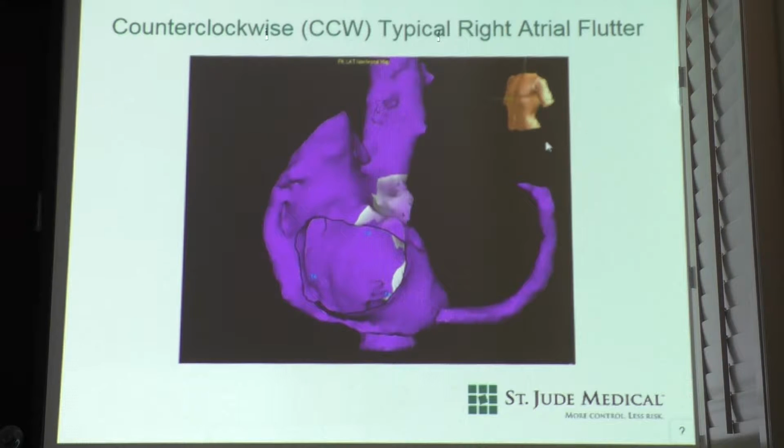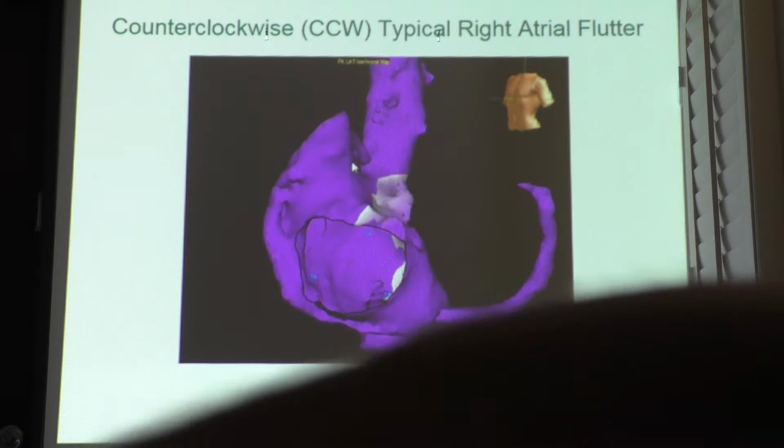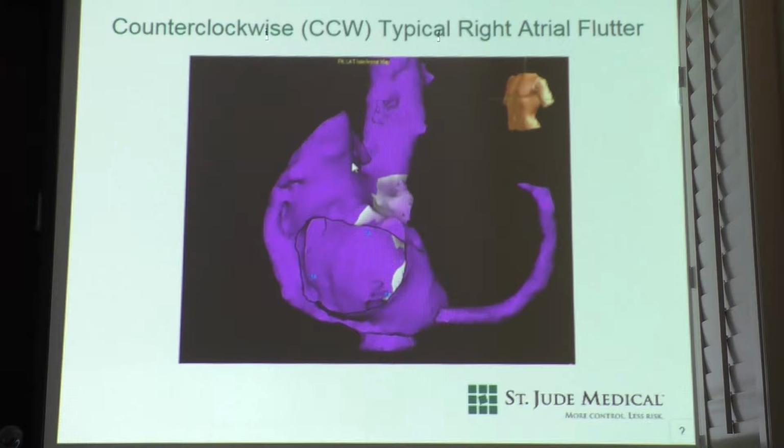And here's a good picture. So this is the inside of that chamber rendered on our mapping system. So what's the tail off to the right? Where'd the little stem go? It's something we went inside, and it's traveling to the left side of the heart. So what do we think that is? Coronary sinus. Yeah, you got it.